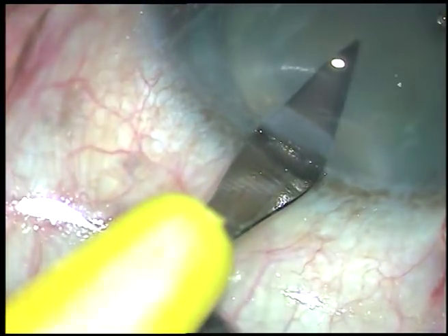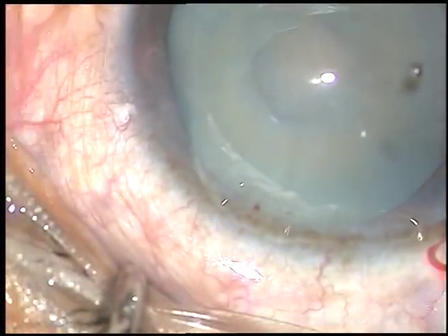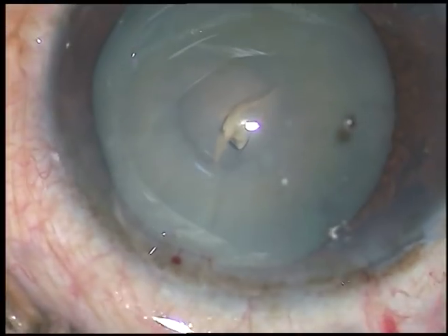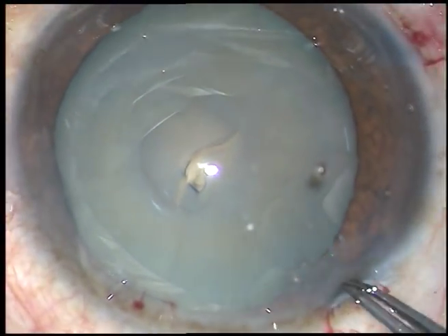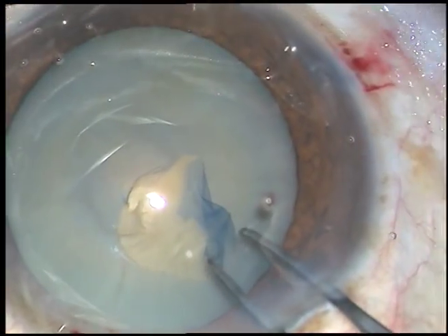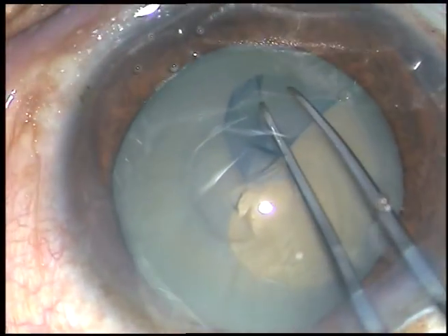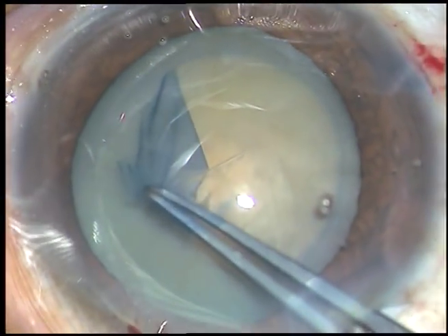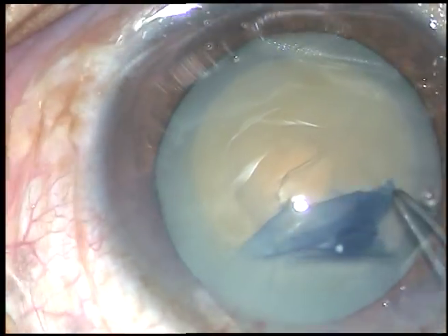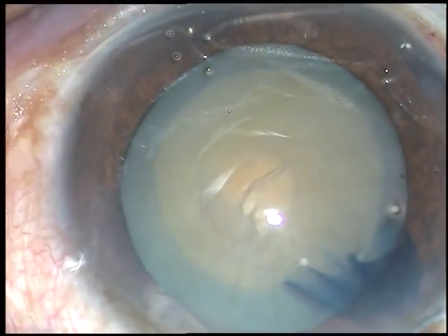Now this is the side port put on the left side of the main incision, and now is the time to do capsulorhexis. A 26-gauge bent needle is introduced through the main incision, the capsule is incised, and a capsular tag is raised. This capsular tag is seized with Utrata forceps. Go anti-clockwise or clockwise, whatever you like, and be at a certain distance away from the margin of the pupil.